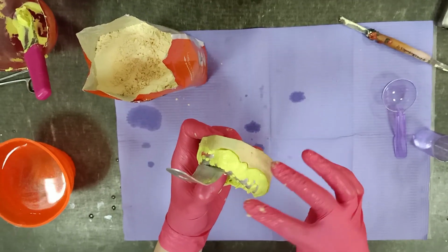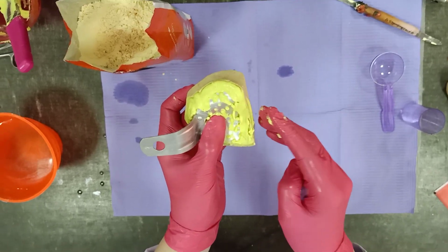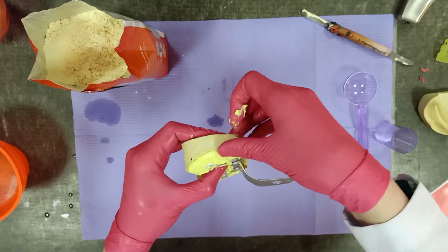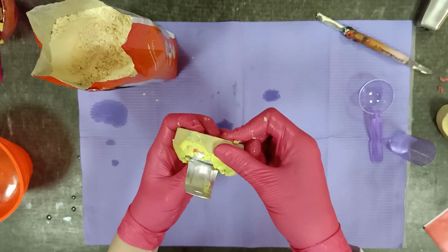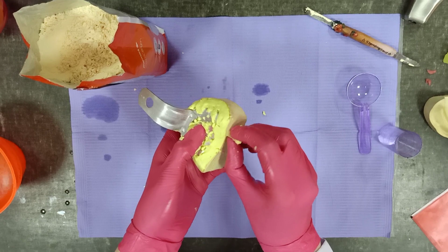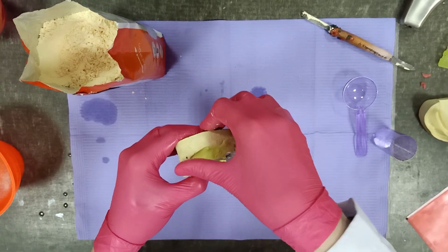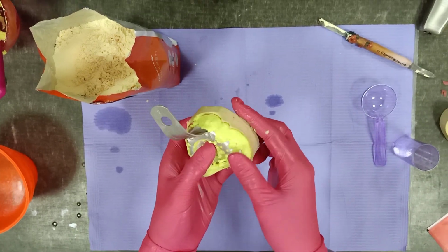Follow the manufacturer orders for the mixing time, working time, and setting time inside the patient mouth or here on the cast. Make sure that all your borders are smooth. Of course, the patient's saliva will make this smoothing, but here on the cast we are using water and our fingers instead of trimming by patient's muscles.